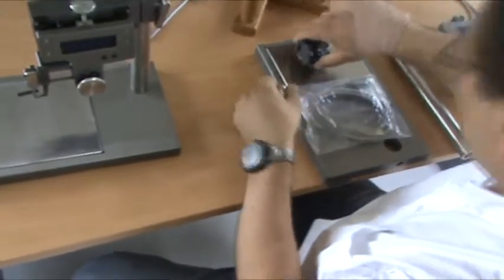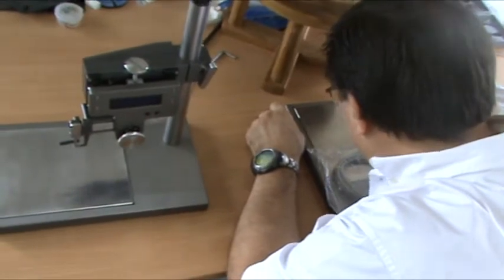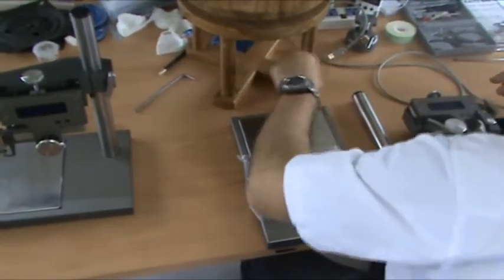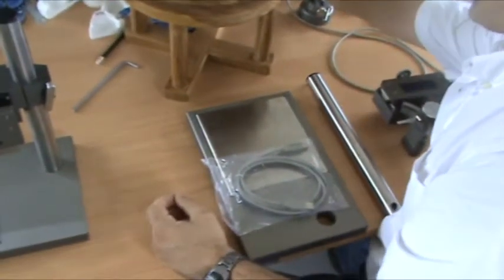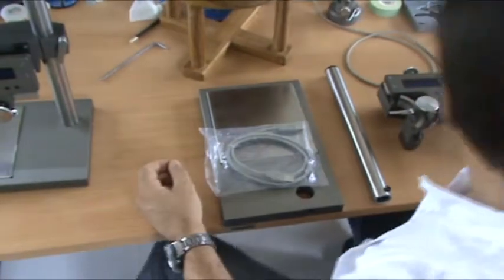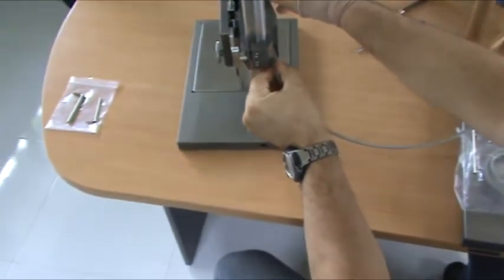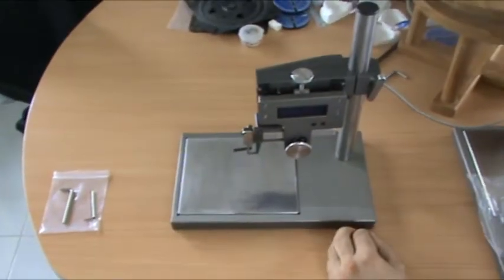The cable, there's a simple printer cable, and an adapter, 220 or 110, either is the same. Put the USB end into the adapter. Then the printer end into the instrument. There's only one way it can fit, and the instrument should come on when we switch up.